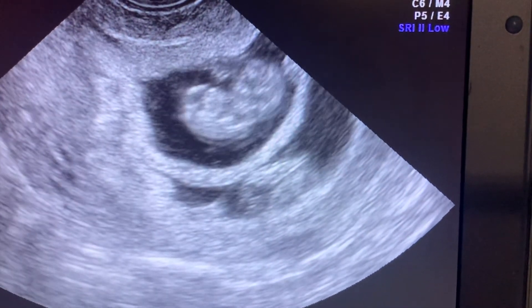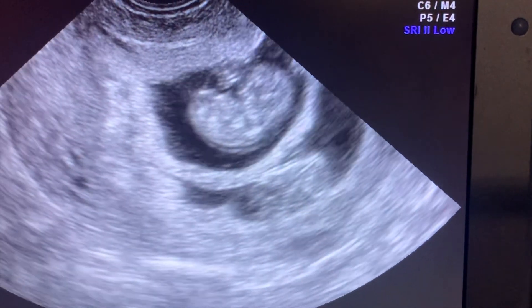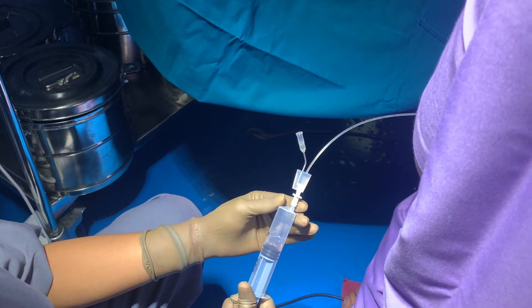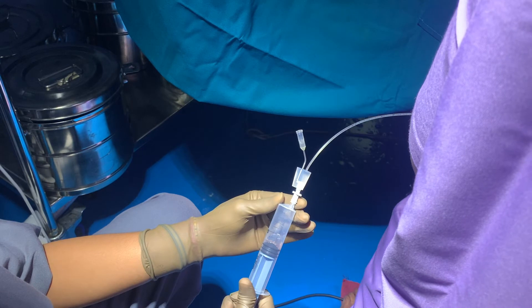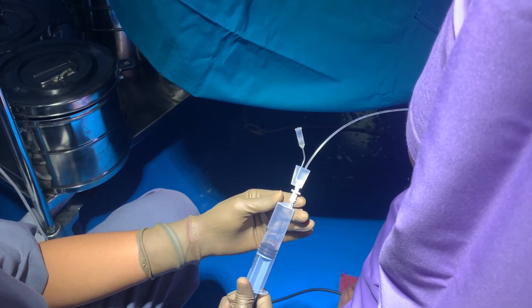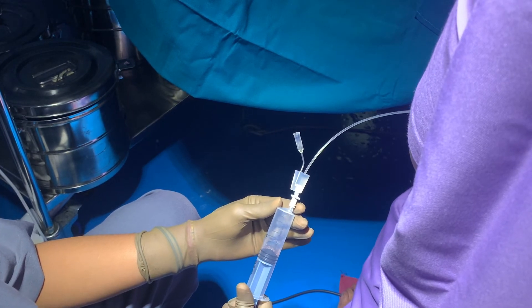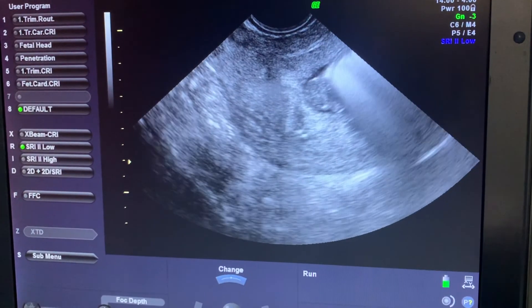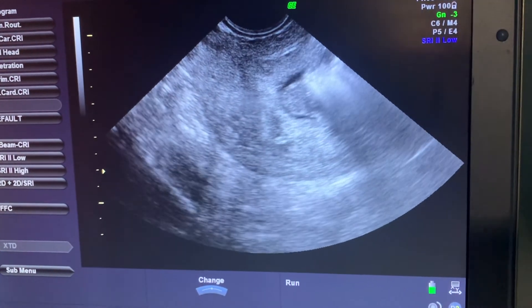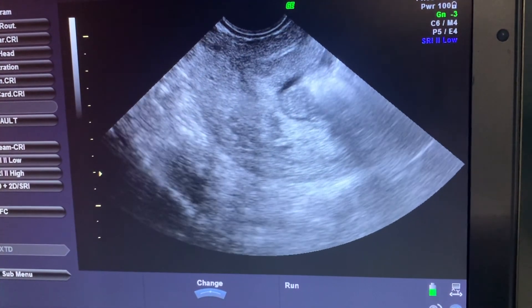The needle is into the baby's heart and you can see the baby's heart beating. This is the syringe which is attached to the needle and it is aspirating the baby's heart blood. Once we are sure it is in the heart, we inject potassium chloride into the baby's heart. This is a picture showing the potassium chloride injected into the fetal heart.